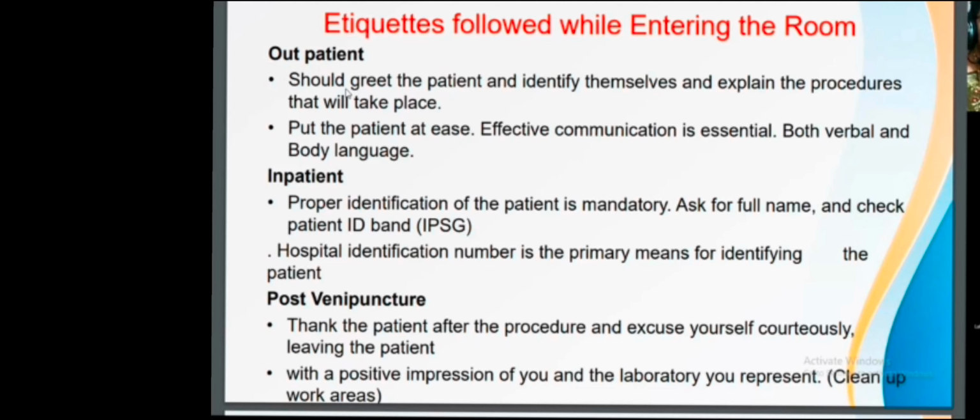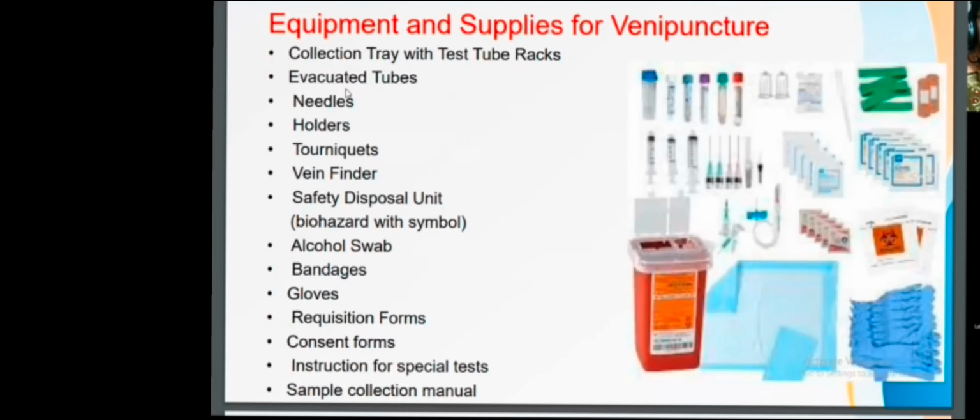Post vein puncture. Thank the patient after the procedure and excuse yourself courteously, leaving the patient with a positive impression of you and the laboratory you represent. Clean up the work areas.